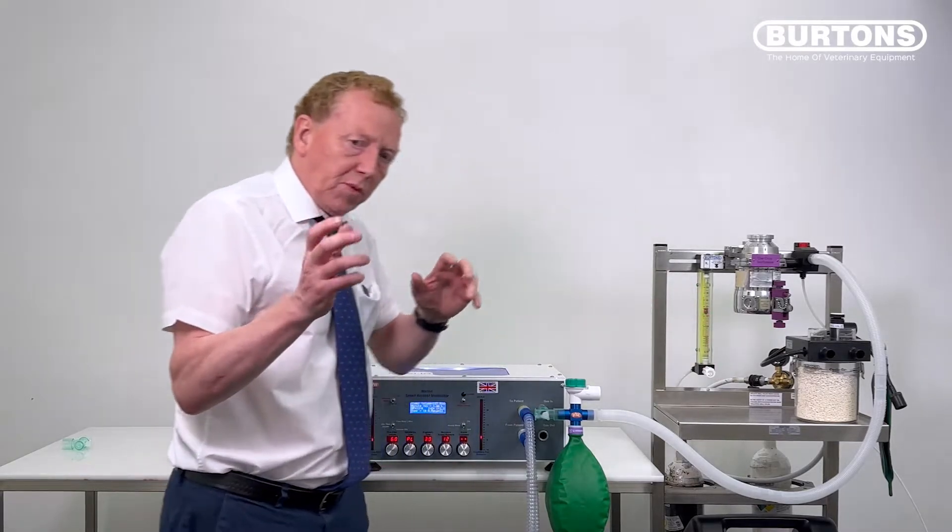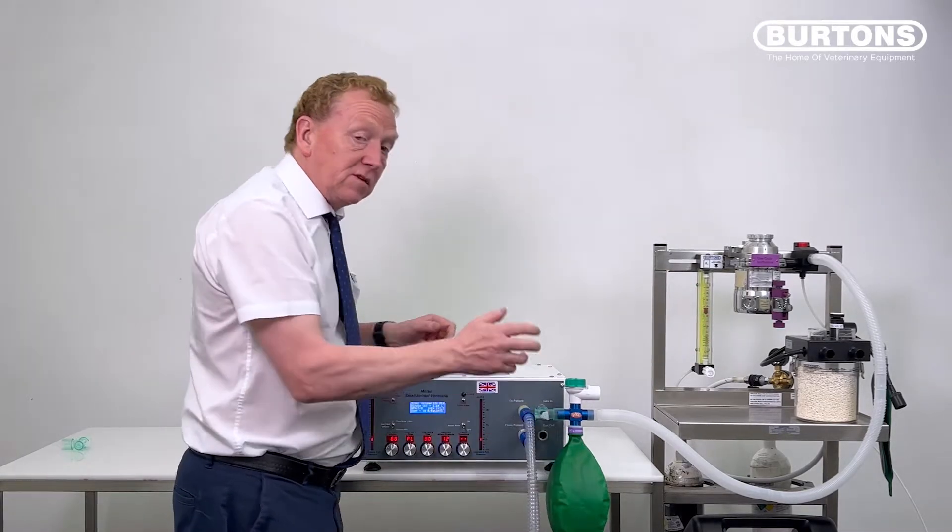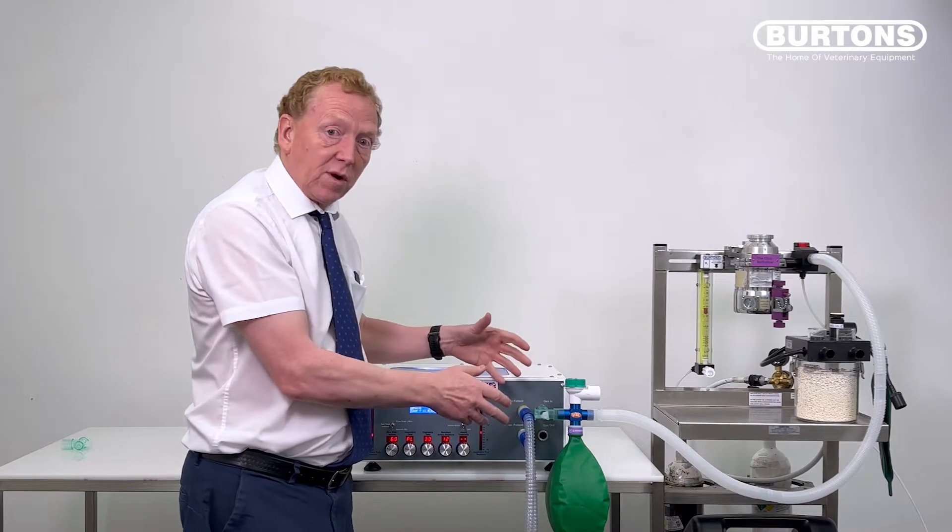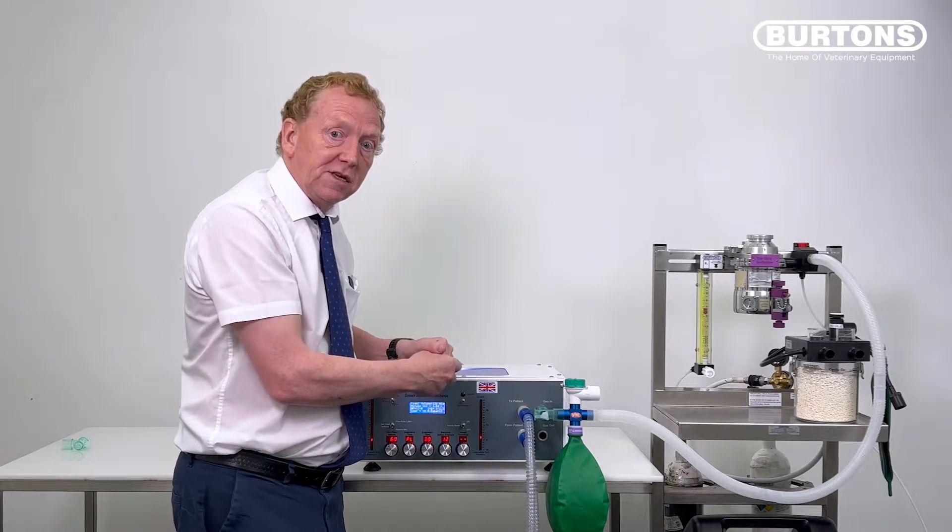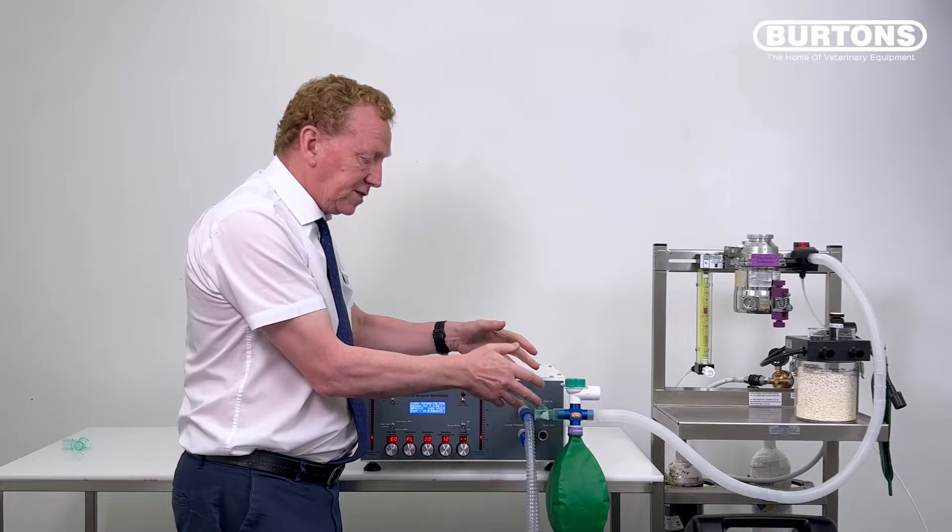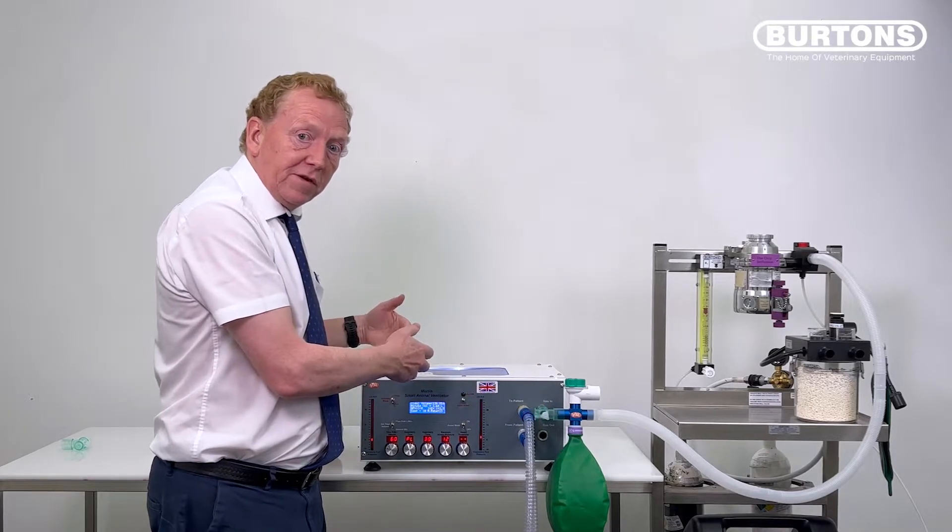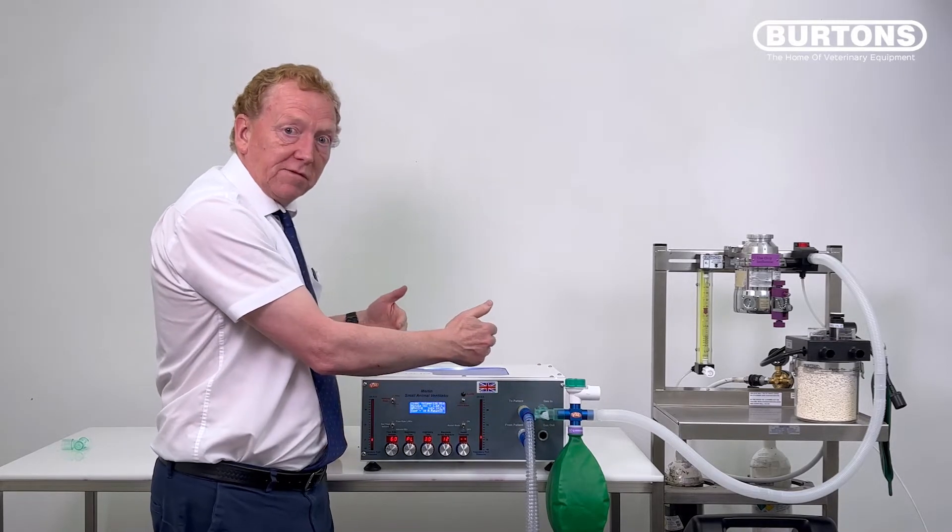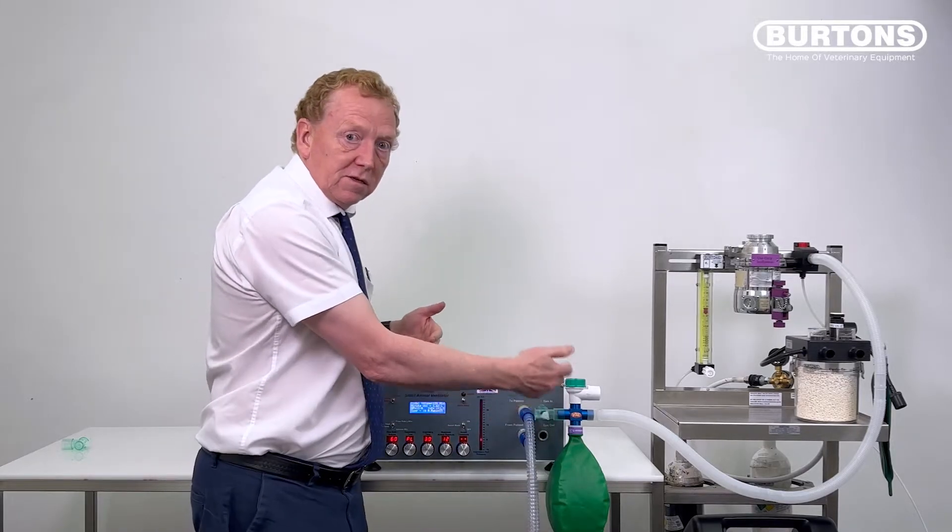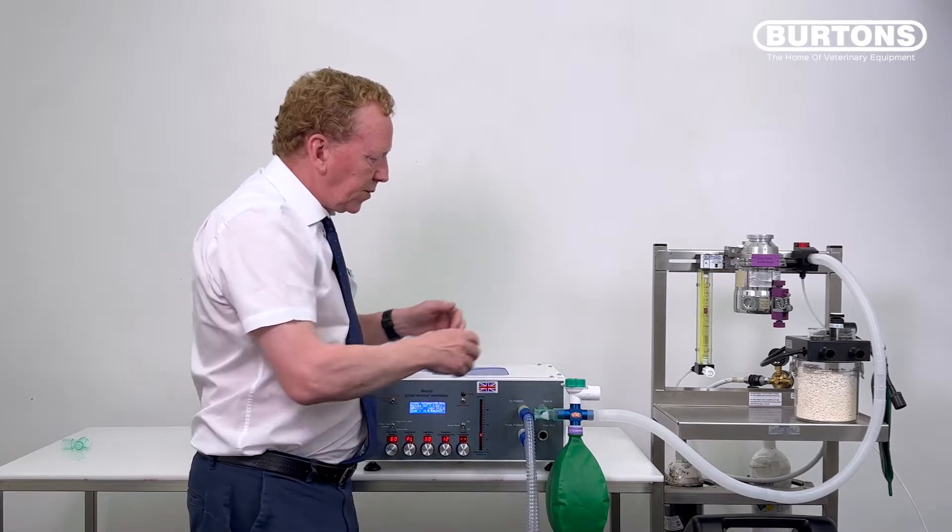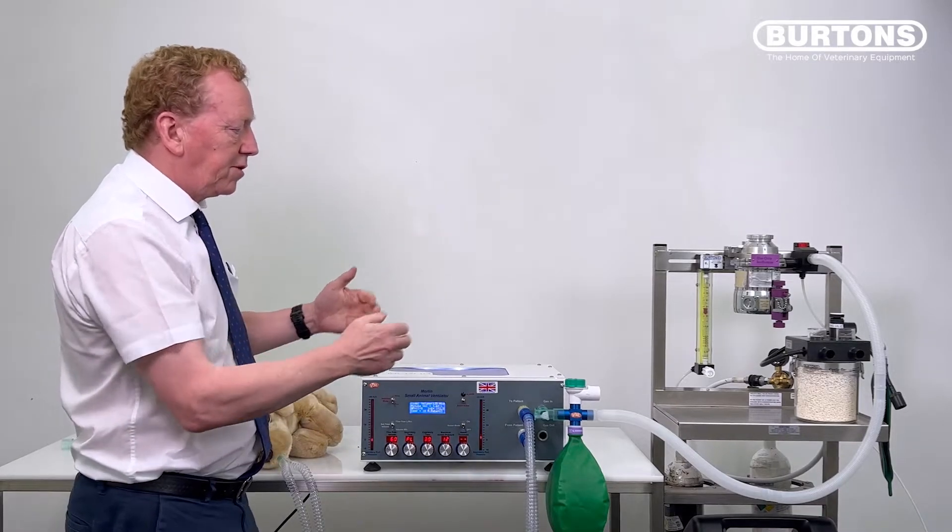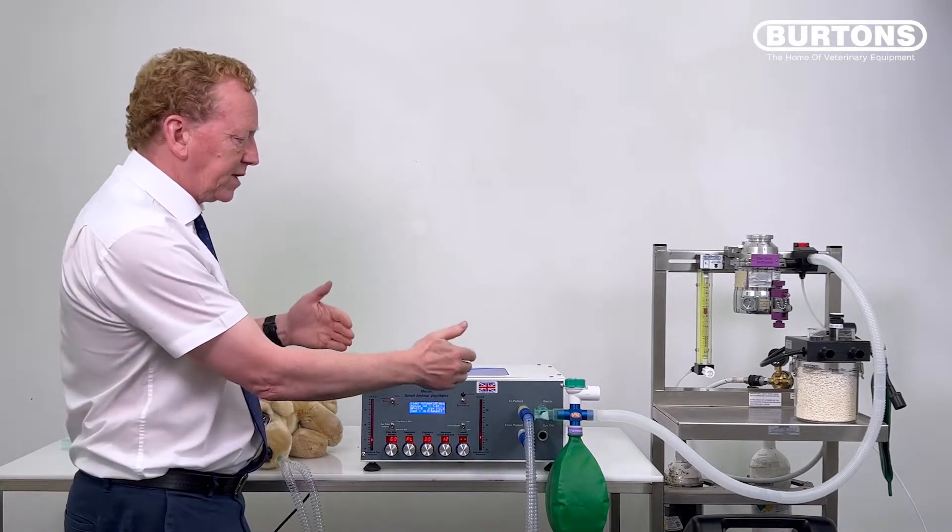So one important point to note is that this reservoir bag is not a patient reservoir bag. It's a fresh gas flow reservoir bag. So it doesn't relate to the patient size, it just relates to how much it needs to fill to allow Merlin to fill up again. And because Merlin is just under a litre, one litre, two litre bag is fine. So this solves the problem for us, for a non-rebreathing circuit.